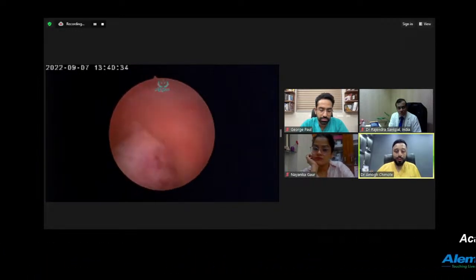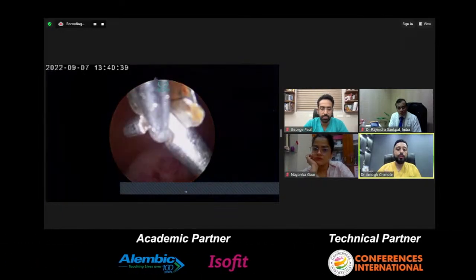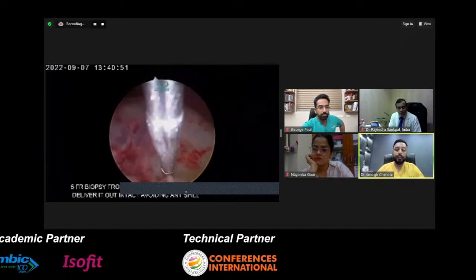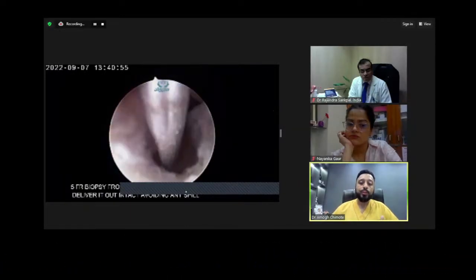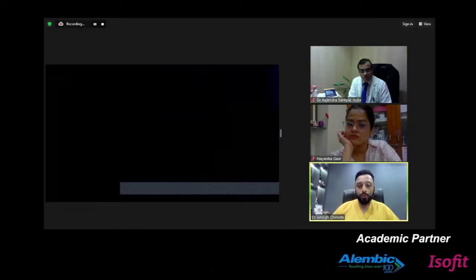Now, as you can see, the entire sac was removed en bloc, completely, without any spillage of amniotic fluid inside the cavity. So the risk of amniotic fluid embolism in this procedure is less if you can remove the sac en bloc.